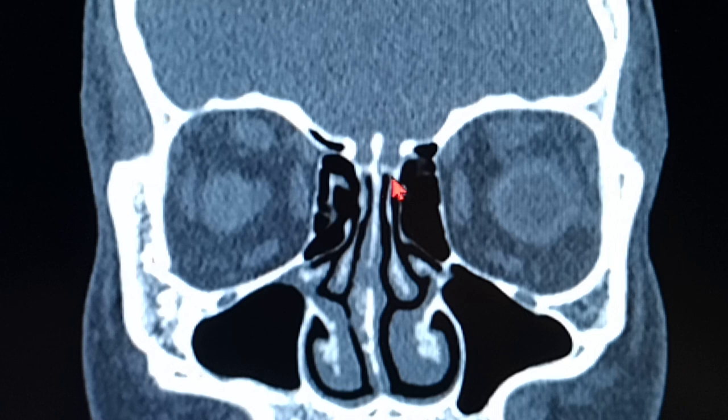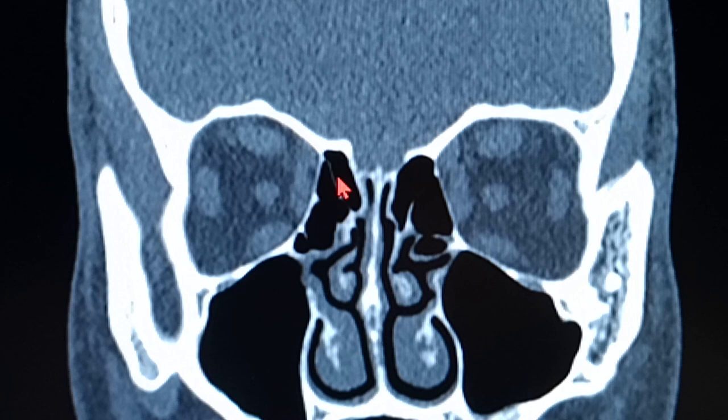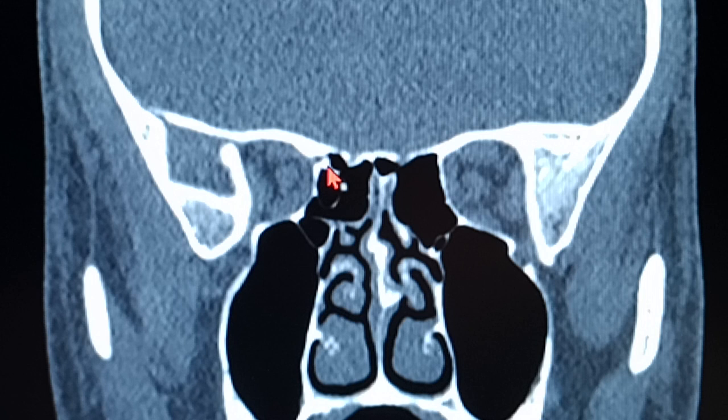Now, that's the more horizontal area, and I'm going to show you the posterior ethmoidal artery, and then I'm going to show you the optic nerve. So still cannot see any nippling happening. You can see somewhat of a canal-like structure through which the soft tissue is going inside. That is basically the posterior ethmoidal artery, and we are still anterior to the sphenoid sinus anterior wall.